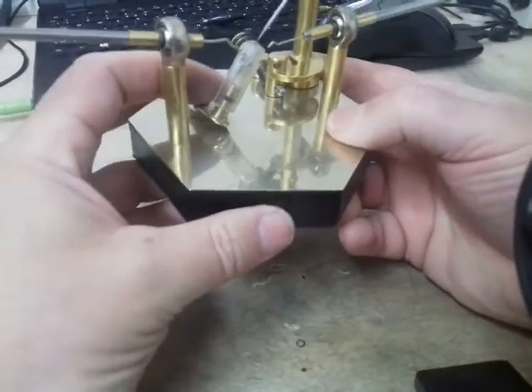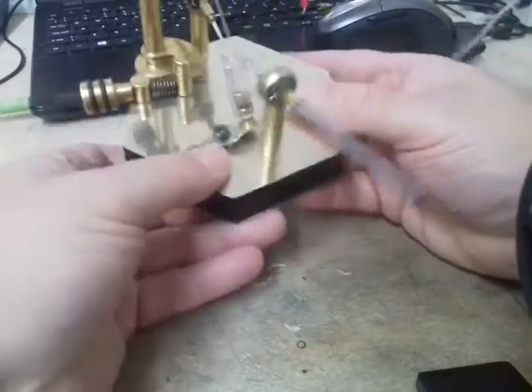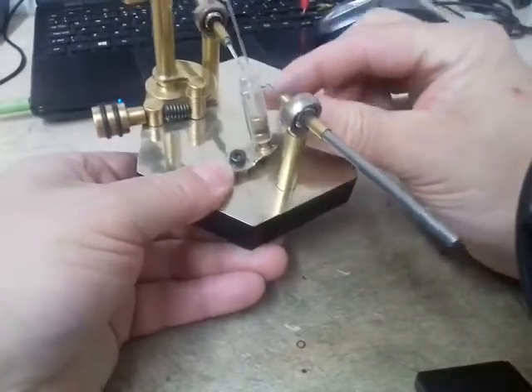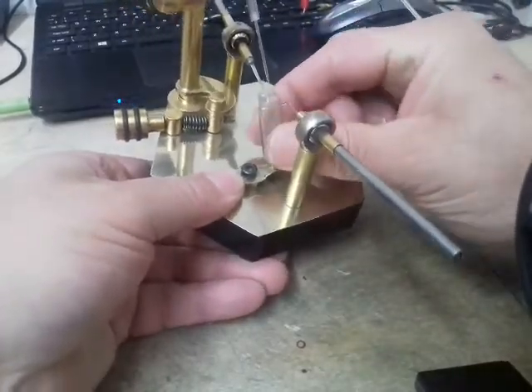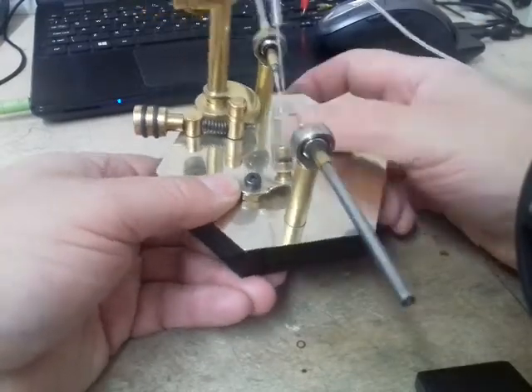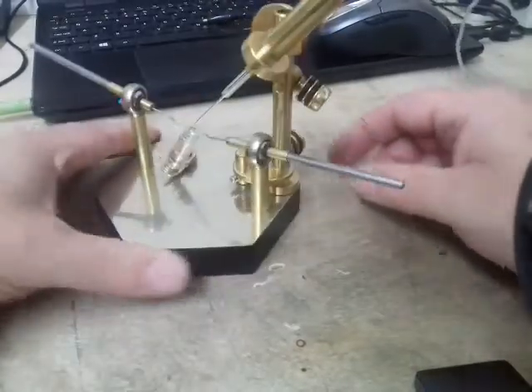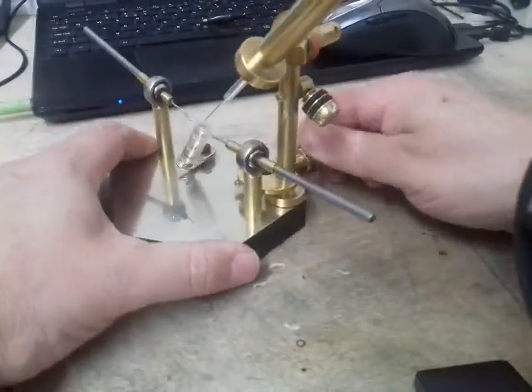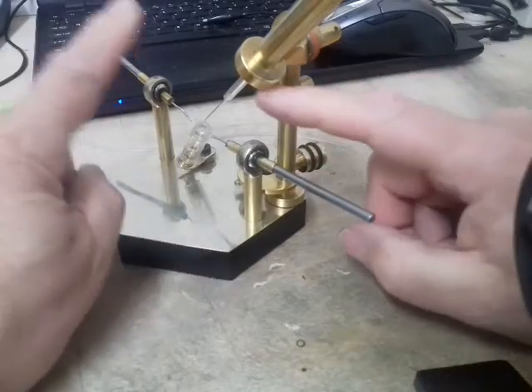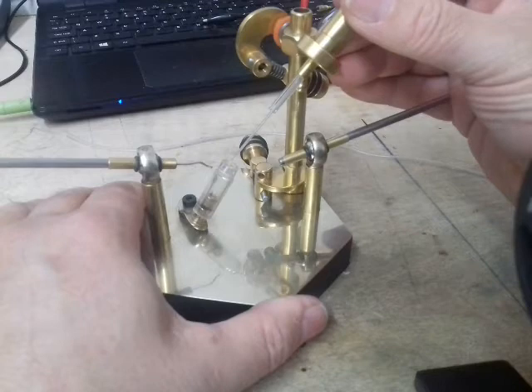The actual queen holder, you can move that, undo the screw here, and you can manipulate that and bend it roughly to where you want it to get to a usable position. Then you never need to move it after that. So there it is. Conventional arms on and a hand feed for the injection.